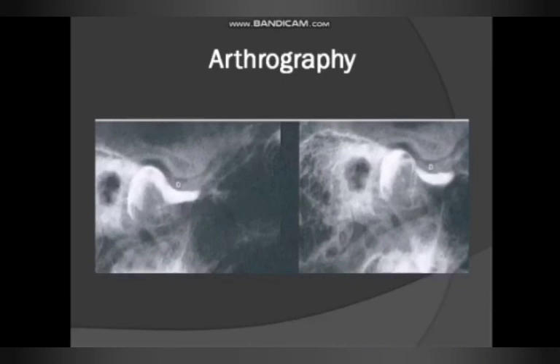We may face complications of the arthrography procedure. We may have complications like joint sepsis, allergic reaction to iodinated contrast medium, pain during and after the procedure, disc perforation, and transient facial paralysis.